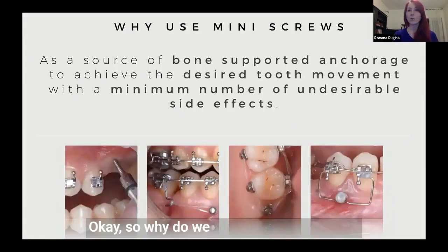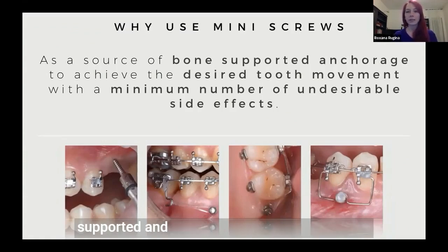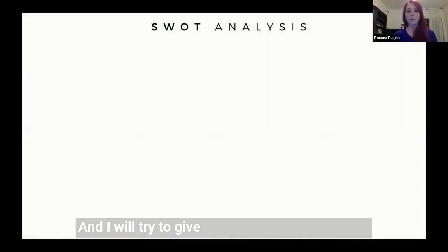Okay, so why do we use these mini screws? Because they are a very good anchorage, bone supported, and we can have the movements we want with a minimum number of side effects. And I will try to give you some examples later.